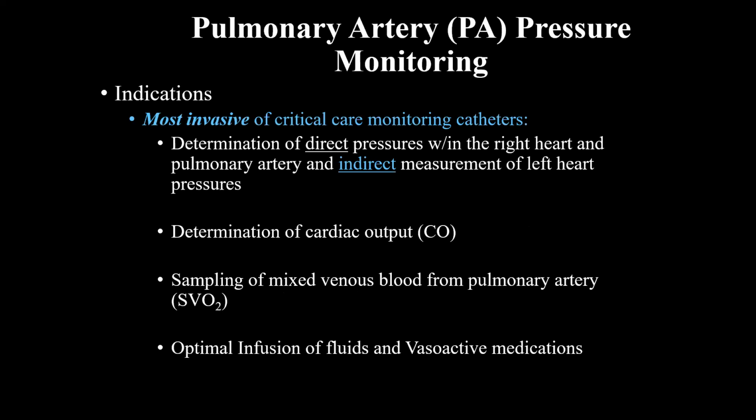Pulmonary artery pressure monitoring. Now remember, this is the most invasive, and this one throws students off. So we're going to take some time on this.